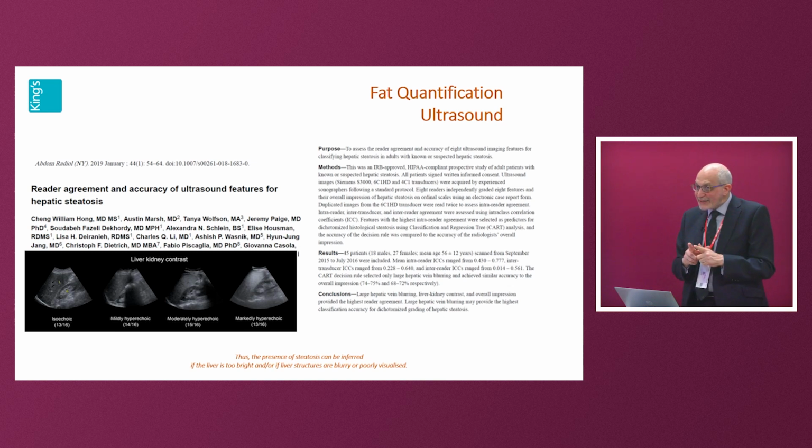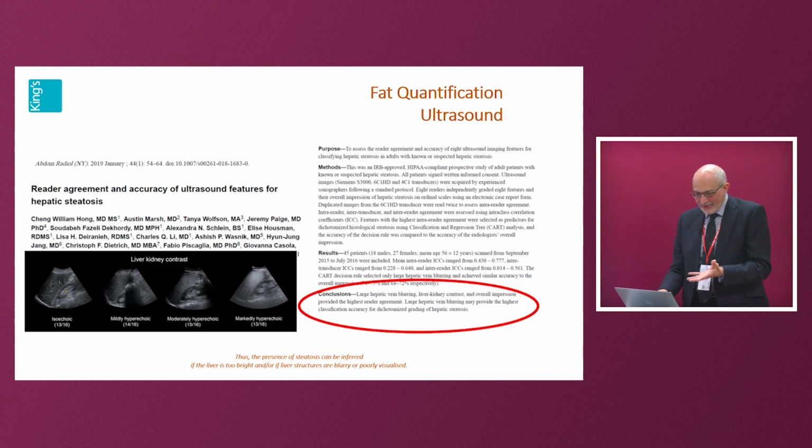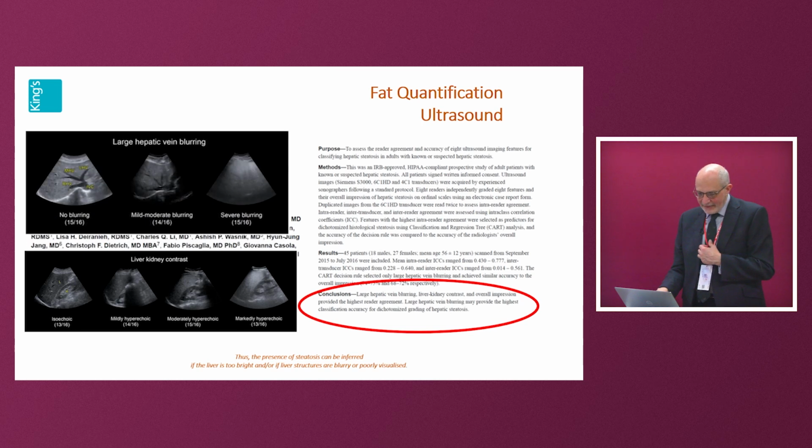Yes, if you're an expert and you do it all the time and you talk to each other and you're consistent. This has been shown in studies of experts, that they more or less agree on it. But it's not going to be universally distributed. And there is no point in just saying mild, moderate, or severe. But it's a time-honored technique, and we will always use it because it's there in our mind. So that's there and available.